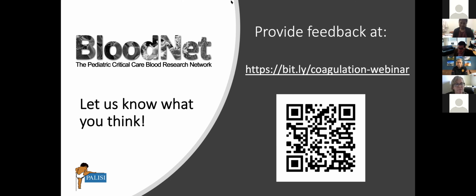Renee Roy asks, how much information does platelet mapping provide for patients on ECMO? And I guess, presuming the direct anticoagulation, if they're not significantly bleeding or not clotting, just in and of itself, do you use platelet mapping, Mira, for patients on ECMO? No, I don't, because you know that platelets are going to be eaten and chewed up in that oxygenator. So we've done it on a couple patients, but you expect to see significant inhibition of the platelets.